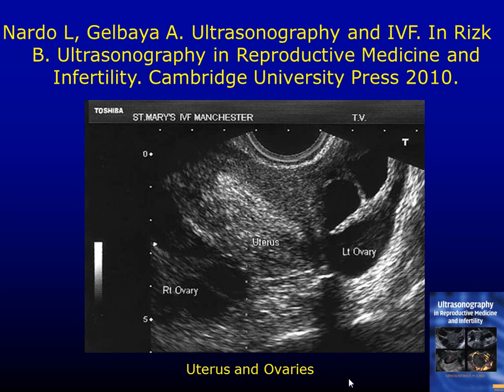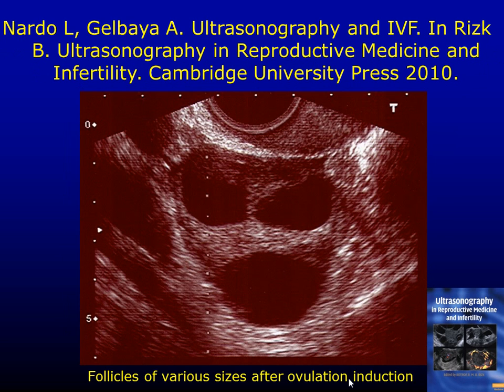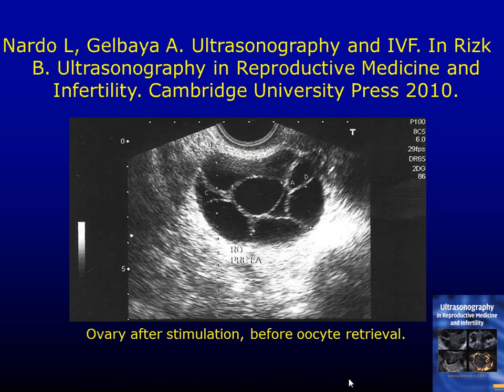Very uncomfortable situation. And one time it is not just positioned behind; it's stuck. So you lift the uterus, it moves with the uterus. You pull back, it comes back, and you lift, and so on. So you have to persuade it, is the word. So here is the ovarian endometrioma and follicles. You leave it till the end, because if you do it at the beginning, you have damaged all your follicles as well. Again, 3 follicles there, 1 follicle and 2 more.